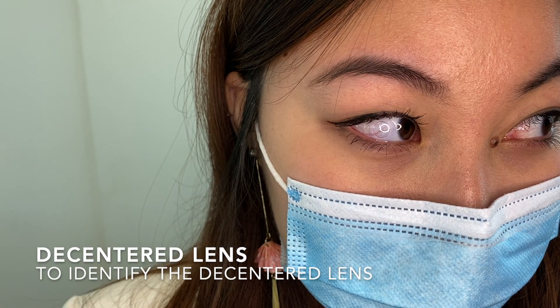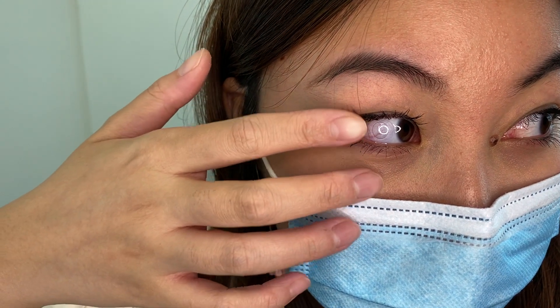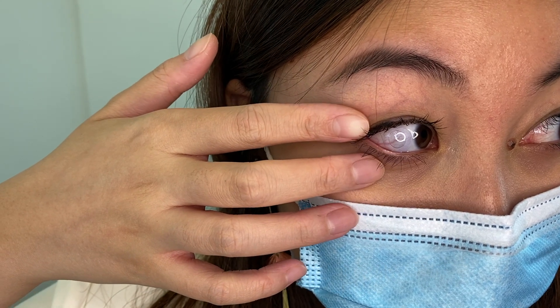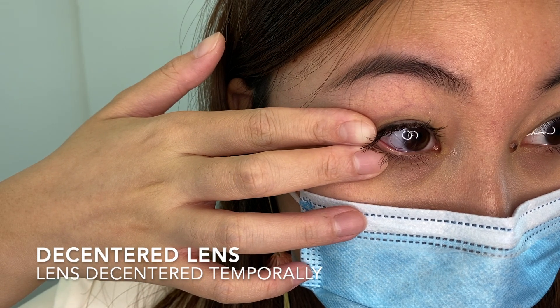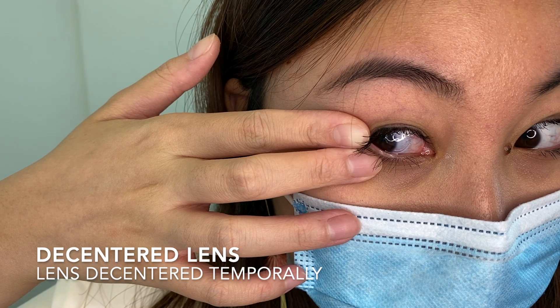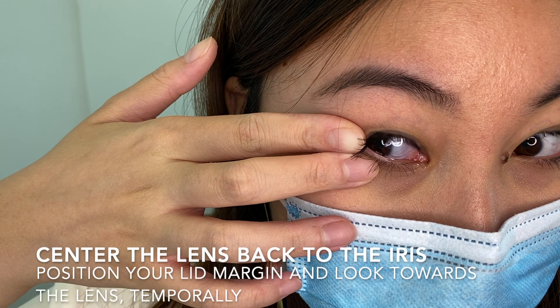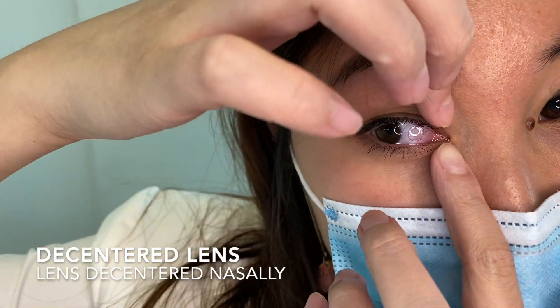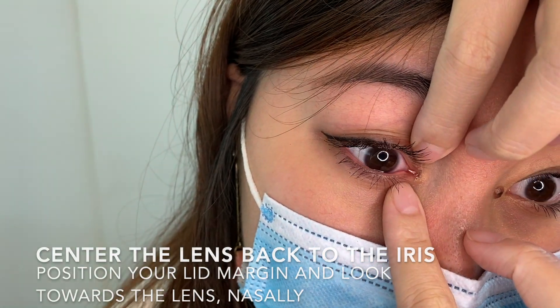I will show you how to centre your lens when they are out of position. First, you need to identify where the lens is. Once you locate the lens, look at the opposite direction of the lens, then look back towards the location of the lens. If the lens is at the temporal side of your eye, look at the opposite direction, which is towards the direction of your nose. Simply angle the corner of the upper and lower lids and look back towards the lens. Your iris and the lens will interlock. If the lens is at the nasal side of your eye, look at the opposite direction, then look back towards the nasal side.